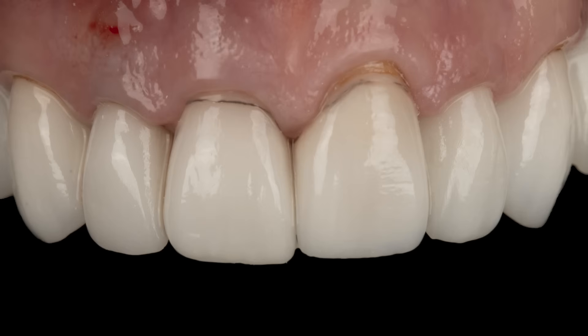Hello everyone. In today's case, we are going to extract an upper lateral, place an immediate implant, bone graft, and immediate non-functional provisionalization in under 10 minutes.